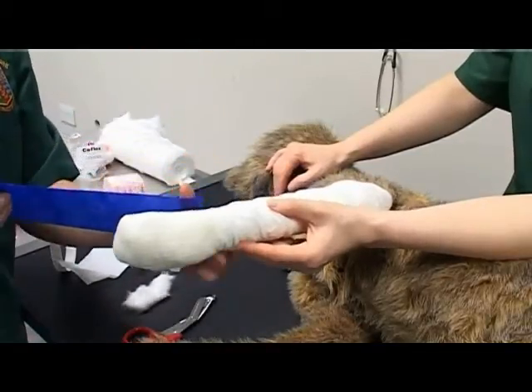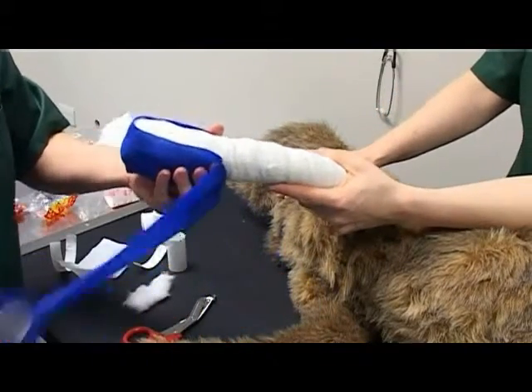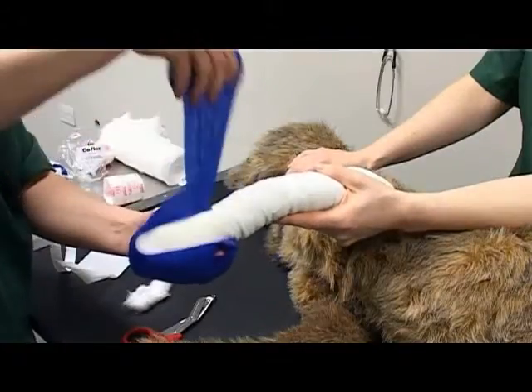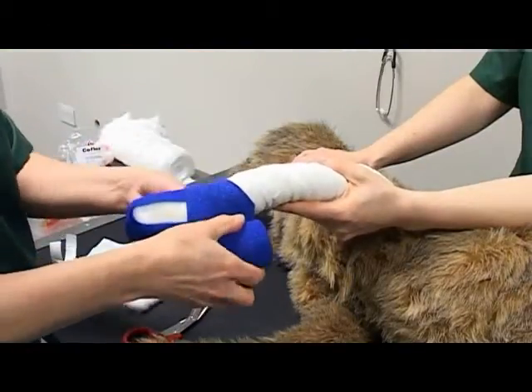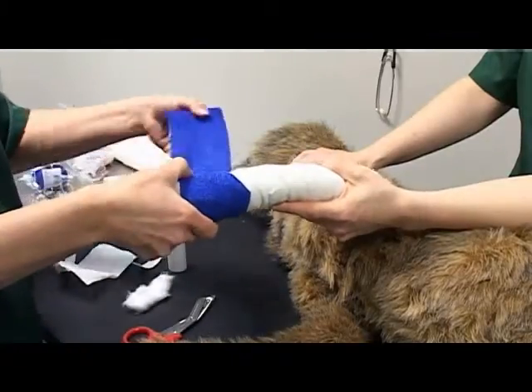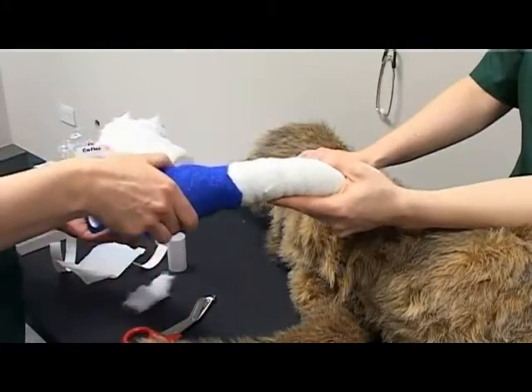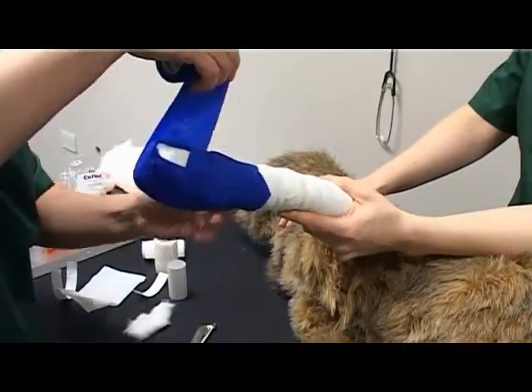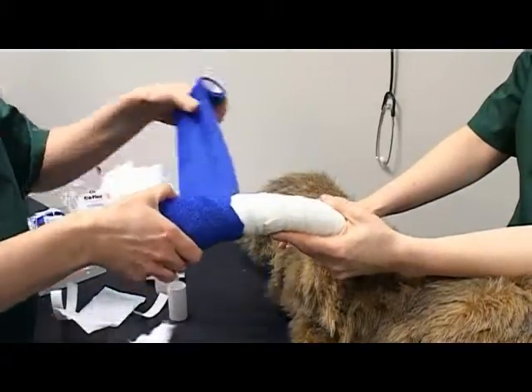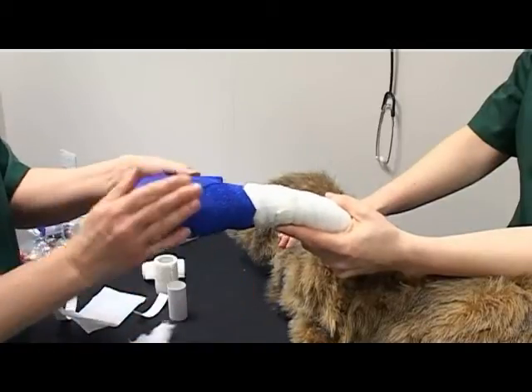Apply the final protective layer, ensuring you have loosened the bandage before laying it. Ensure there is no tension or tightness in this layer. For the outer protective layer, apply distally to proximally, ensuring the foot and elbow are included.